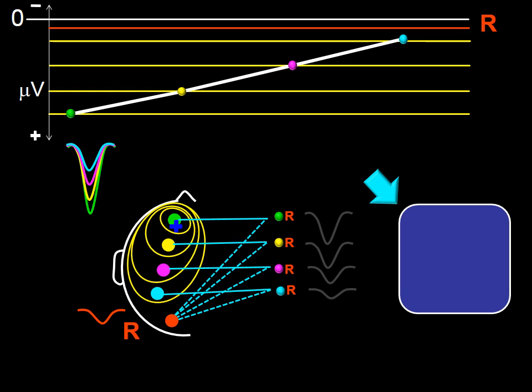So inside the amplifier, certain things happen in order to produce a wave of a given amplitude and polarity. That is, in this blue box, I will show what happens when we connect the non-reference electrodes to the differential amplifier input 1 and the common reference electrode to input 2 of the differential amplifiers.